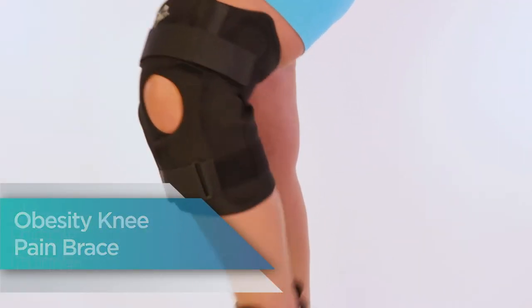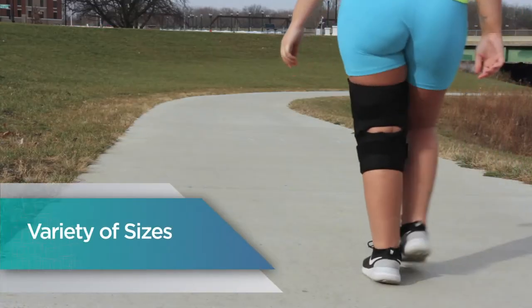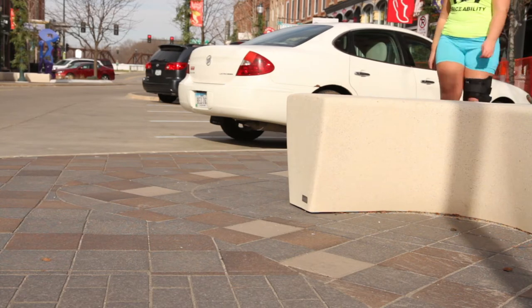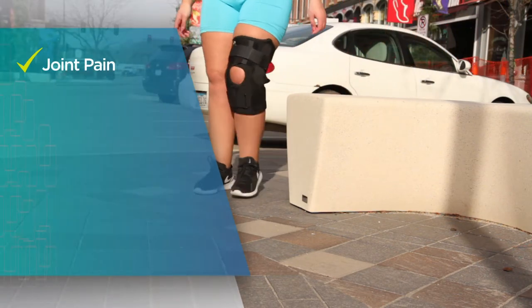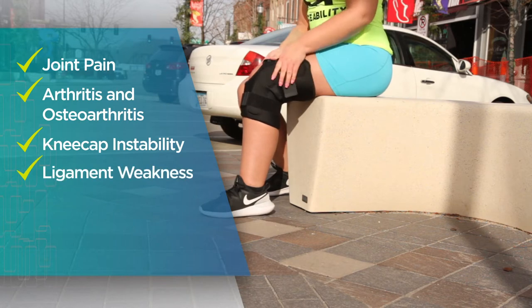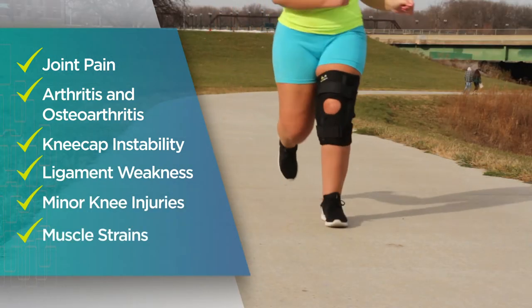Obesity knee pain brace by Braceability. Available in a variety of plus sizes, fitting overweight to morbidly obese men and women. Helps alleviate discomfort associated with joint pain, arthritis and osteoarthritis, kneecap instability, ligament weakness, minor knee injuries and muscle strains.